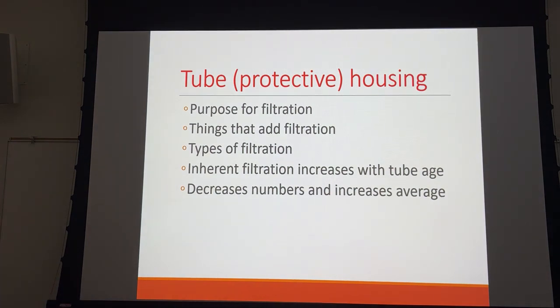but in some cases we still do see them. Scoliosis series, and it's not really a compensating filter as much as what it is a radiation limiting device. It's kind of like the demographic that we usually shoot scoliosis series on are young women and girls with developing breast tissue.